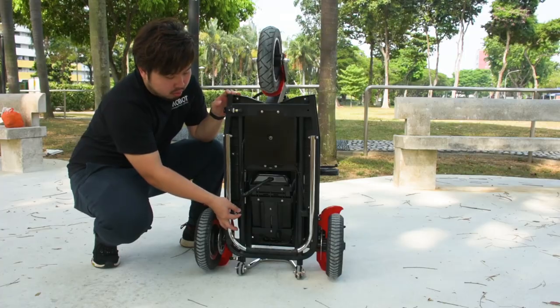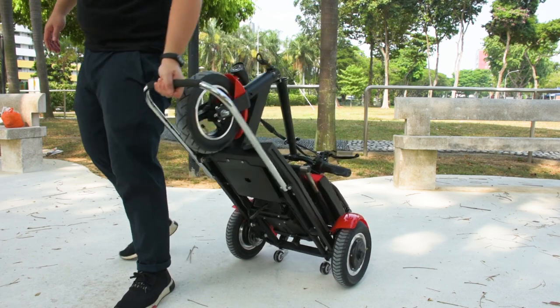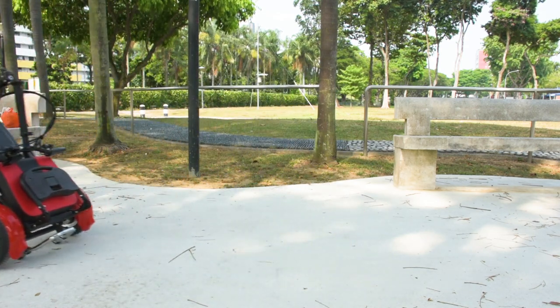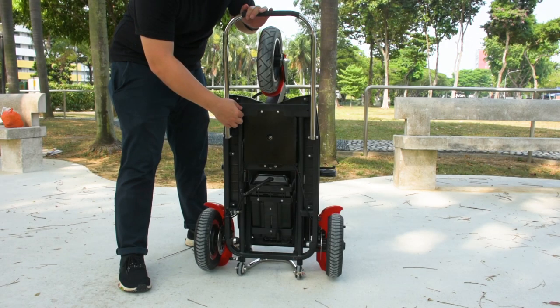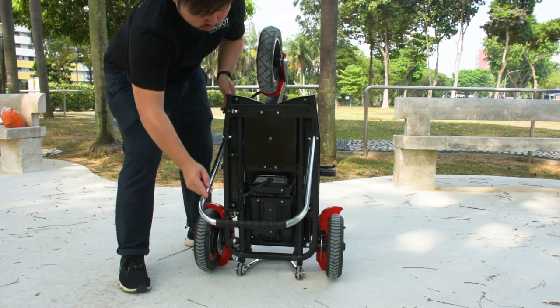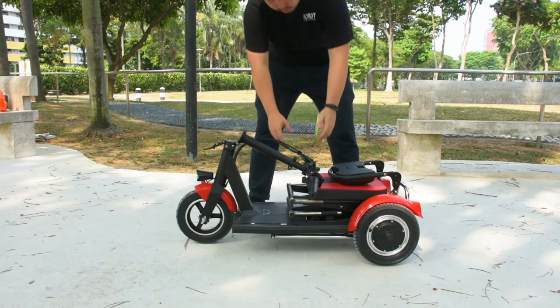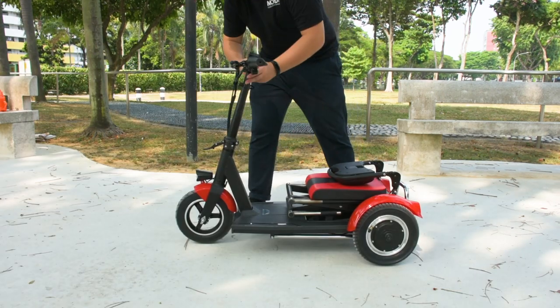If you intend to pull the Flexi around, there is a trolley bar located underneath the Flexi Pro. Unhook the latch, bring up the trolley bar, and hook it back in place. With the trolley bars out, you can pull the Flexi Pro around easily. When unfolding, if the trolley bars are extended, always remember to hook them back underneath the scooter as the bar may impede movement over humps. Bring up the handlebars and lock the latch back in place.